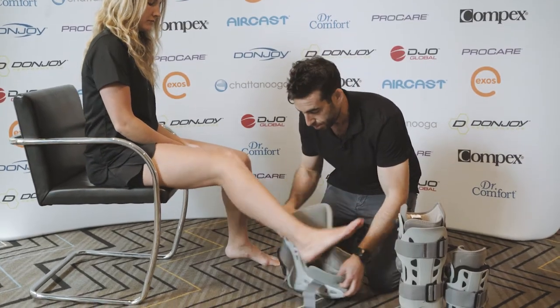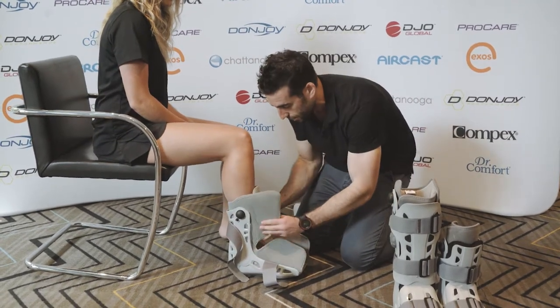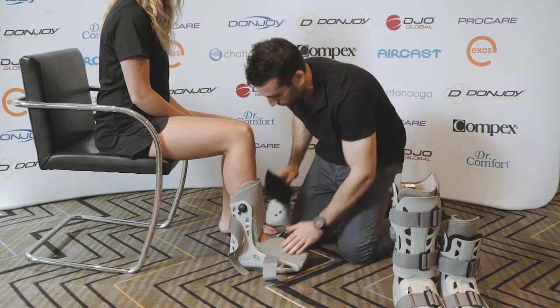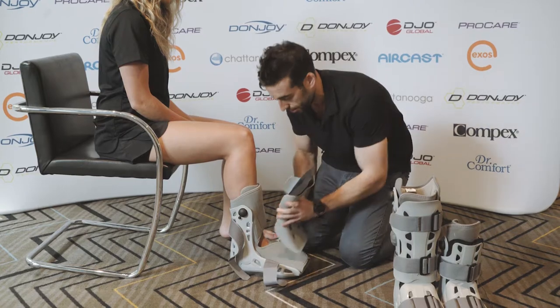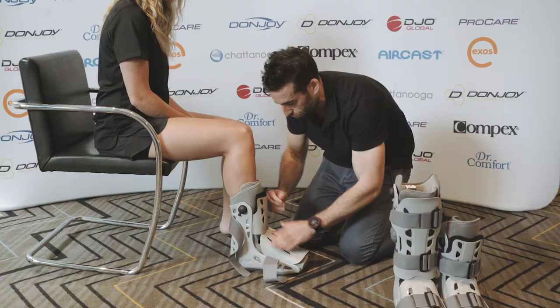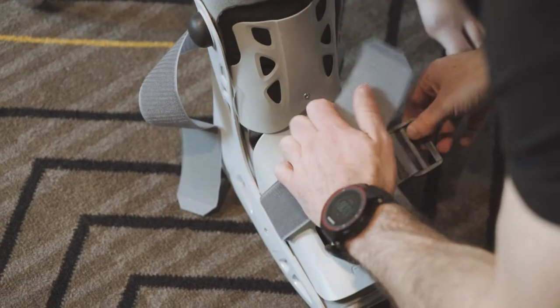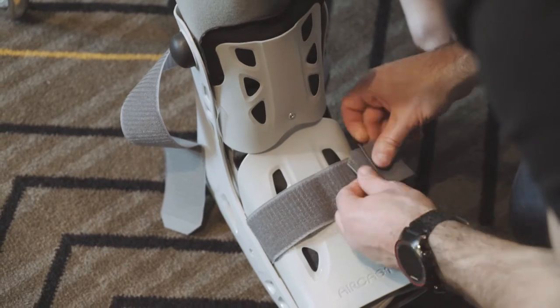Part of putting on the air cast boot is to make sure the patient's heel is right back in the boot so they don't slip out. Then it's very straightforward — just putting the covers on top following the velcro. You have to make sure when the cover goes on that the air cast is at the bottom; sometimes it might seem to go the other way, but it should sit firmly with the velcro. Then you use the straps to make it secure.